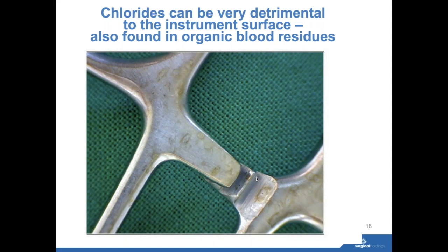Okay, perfect. So picking up from what Bob said earlier, there's the vital importance of making sure that the devices are cleaned before they're passed to CSSD, because of the issues around transit times and potential off-site sterilisation, where the bioburden could remain on the instrument for longer than we'd like, and that could start to initiate damage.